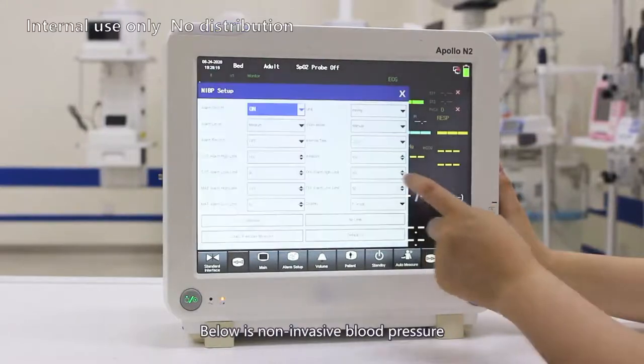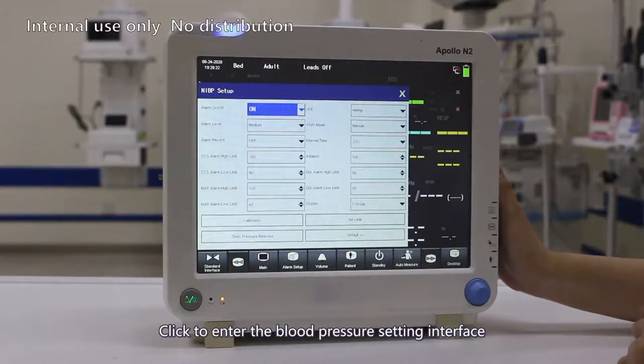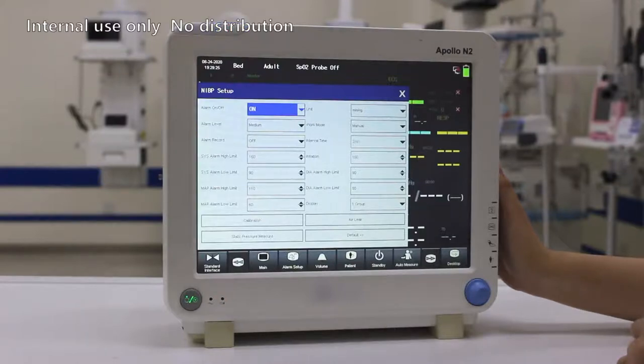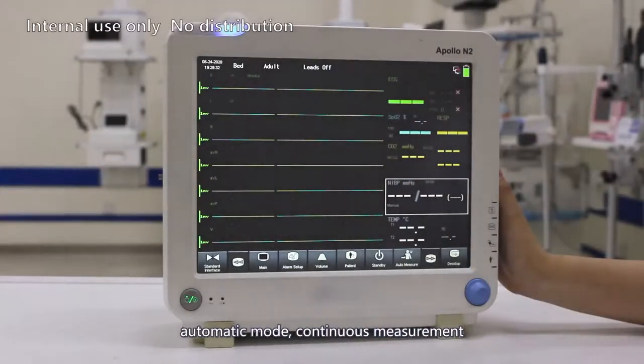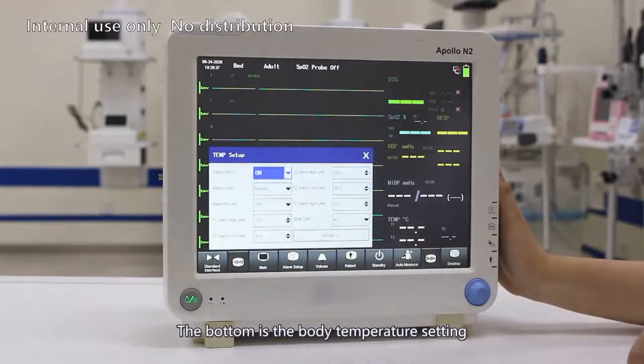Below is non-invasive blood pressure. Click to enter the blood pressure setting interface. You can set the measurement mode. There are three modes: automatic mode, continuous measurement, and manual mode. The bottom is the body temperature setting.